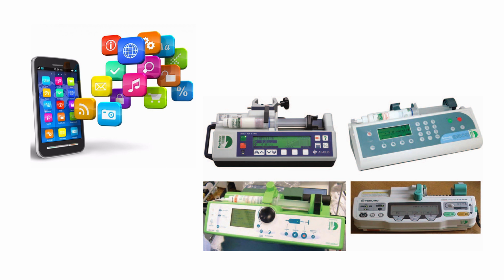Another way is to administer medications with the help of pharmacokinetic models, incorporated in an application, a simulator or a target-controlled infusion (TCI) system. In principle, it seems the ideal tool, since we can estimate the plasma levels and the effect of the drugs that we are infusing. However, the difficulty of this principle is that the drugs have a behavior when they are alone and a very different one when they coincide with others simultaneously in the effect site. Although this pharmacokinetic form aims to establish a desired concentration, it ignores the pharmacodynamic interactions of the drugs: addition, synergy, or infra-addition.